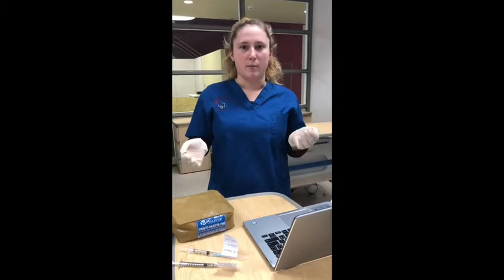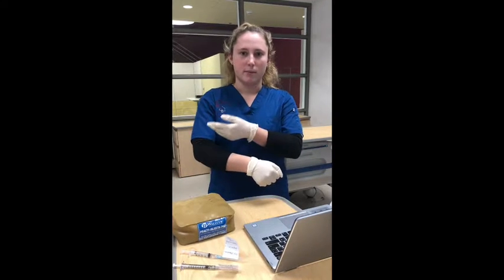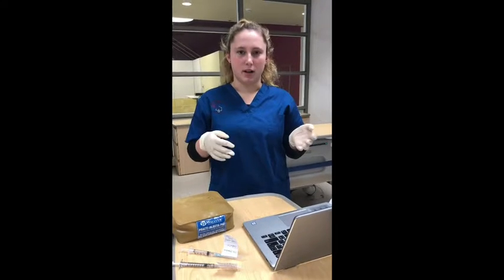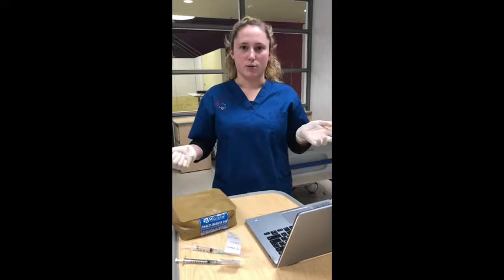And I would also let him know that I'm going to be giving him an intramuscular injection into his deltoid, because it's less than 2 milliliters, so it's safe to put in his deltoid, but I could also use his ventrogluteal muscle, or I could use his thigh.